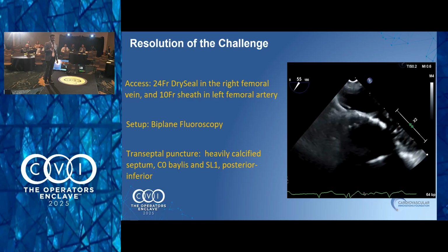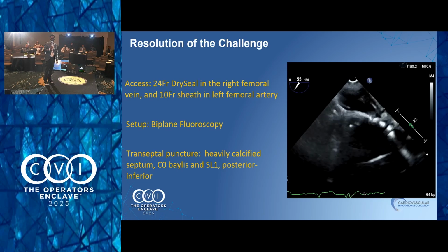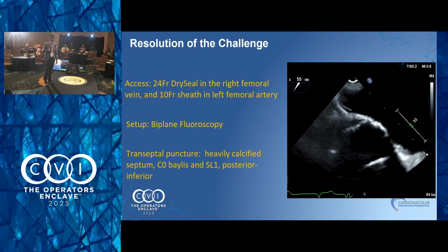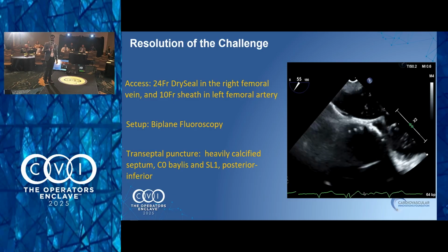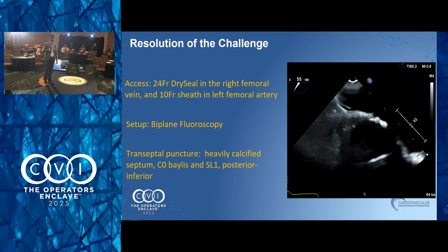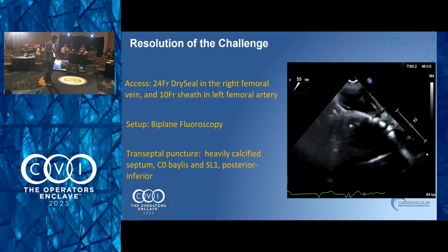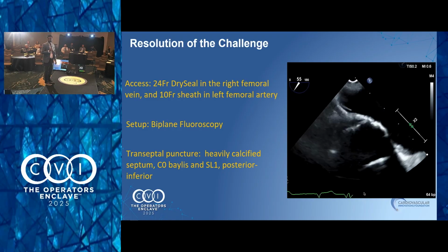How do you size your plugs? Do you do sequential plugs, 2 at the same time? I would go at least 3, hopscotch technique. You'll need to make sure you move your wire. It's a big hole. I'll be shocked if just 1 plug can cover everything. You need to make sure your disc doesn't overlap with your mechanical valve. You can use a really big device and overhang too much on the mechanical valve. I think a single device is too much risk of prosthetic leaflet impingement. A rail is actually a great idea, especially if you're talking about multiple plugs.